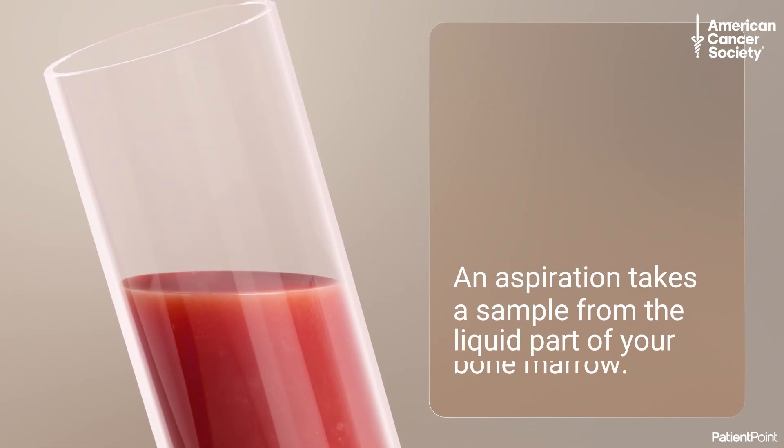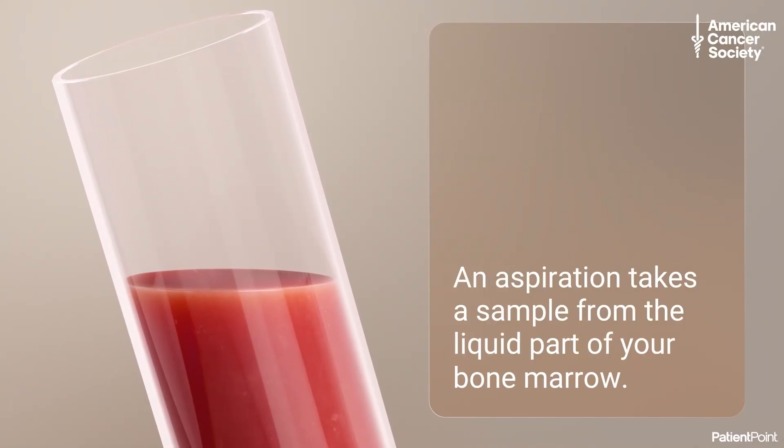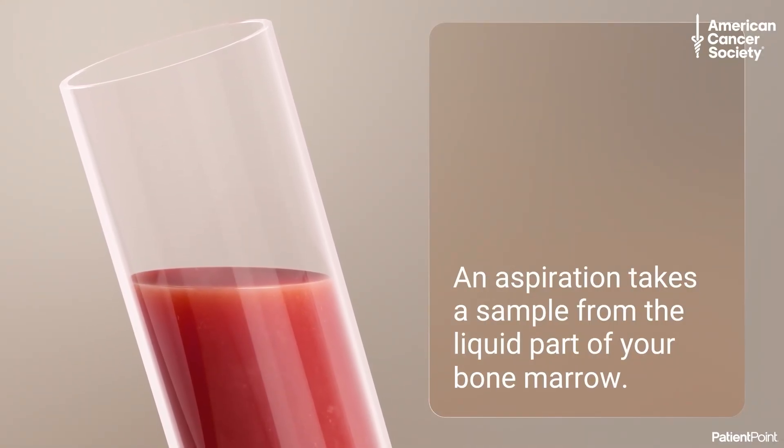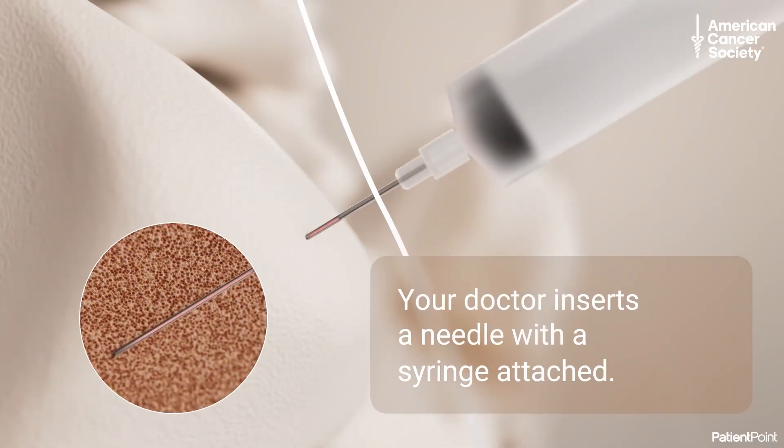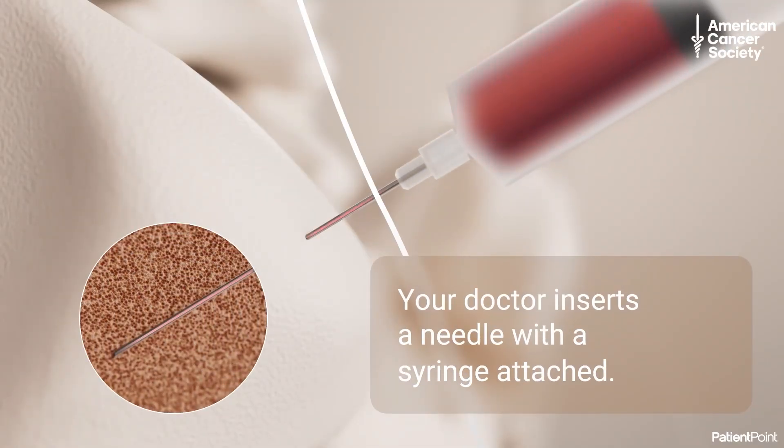Before your biopsy, your doctor may also do a bone marrow aspiration to take a sample from the liquid part of your bone marrow. For the aspiration, your doctor inserts a smaller needle with a syringe attached to pull out a sample of the liquid bone marrow.